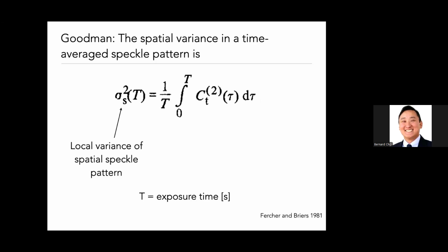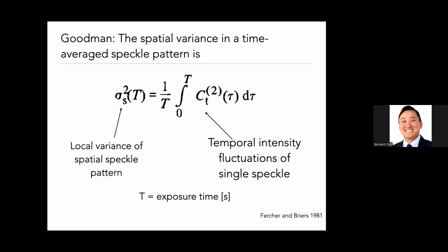So if you look at just how the pattern varies in a small area, it's kind of a remarkable thing. Based off of that, you could then infer how that speckle pattern is changing over time at that local area. So from just a single image and the statistics of that region of the image, you can actually infer time-wise what's going on, with some limits. It's kind of a bizarre concept.